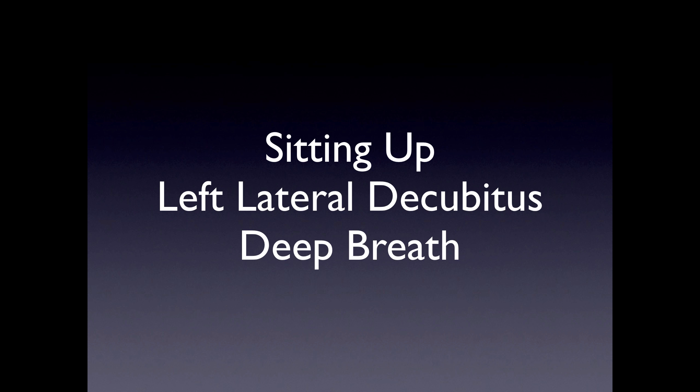I usually ask the patient to take a deep breath and hold it, and then do a few seconds of imaging. Most other ultrasound images are obscured by a deep breath, so don't do this for every exam you do. But in the right upper quadrant exam, it is highly beneficial.